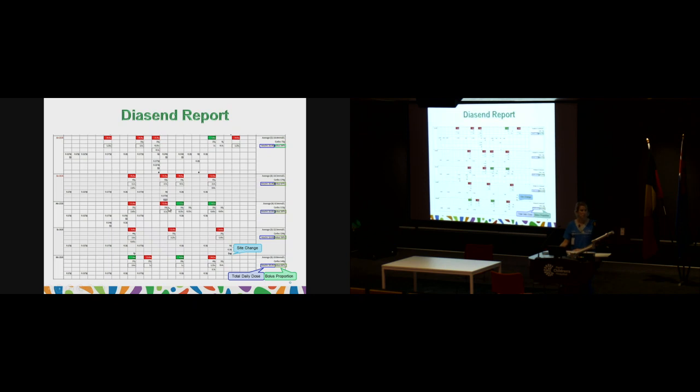In a Diasend report — for patients using the Tandem pump — this is what your report looks like. Down at the bottom it shows where your site has been changed with a little symbol. The total daily dose is shown down the side: each day has a total daily dose, and to work out your average you add all five together and divide by five. That helps us work out how to make adjustments. Next to that it shows your bolus percentage for each of those days as well.